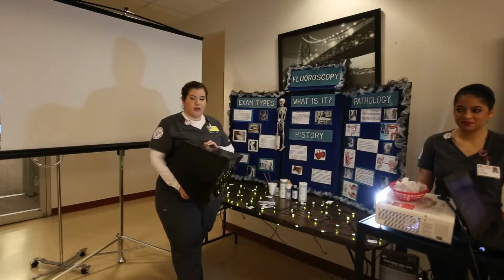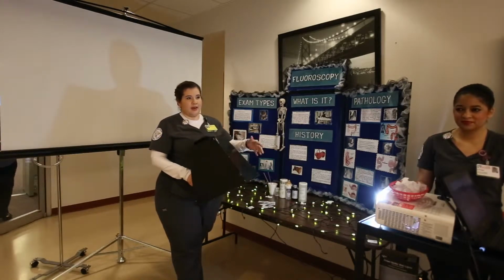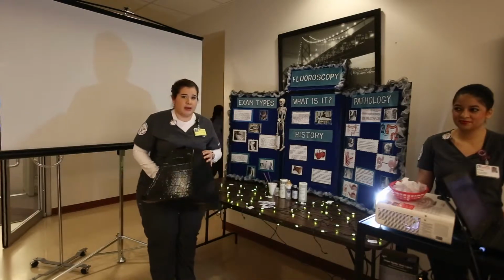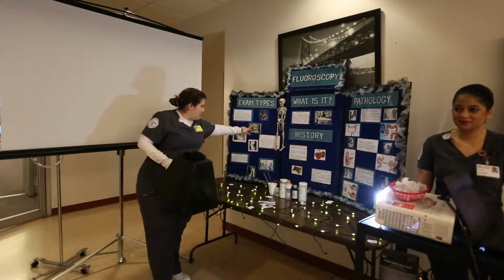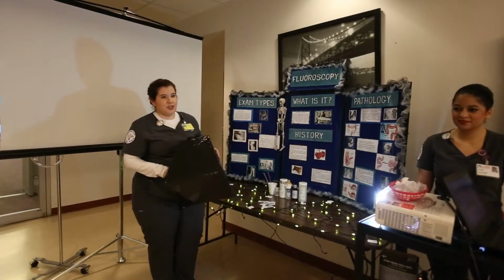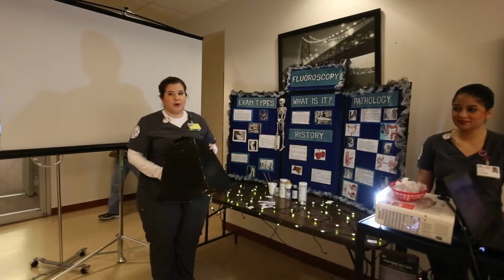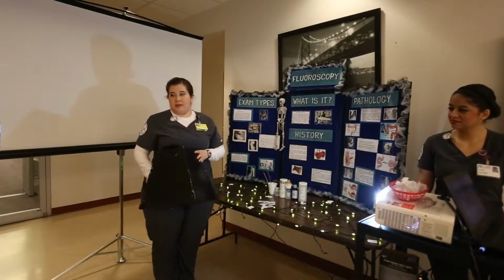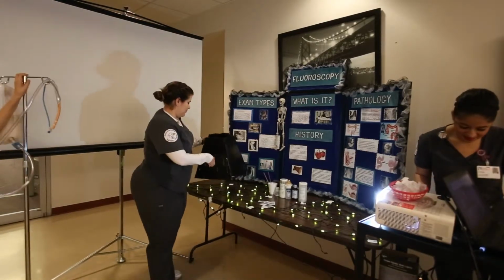The problem with that is, of course, it's very dangerous to be in the line of radiation that closely. So later on, they made better models that look something like this, and they're a lot safer to use. Again, like I mentioned, the purpose of fluoroscopy is to identify abnormalities in the anatomy, and this will explain it.